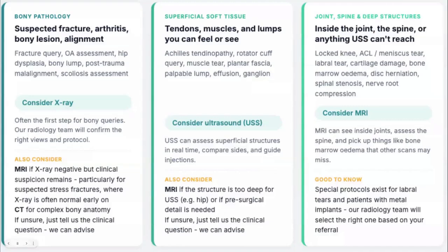There's quite a lot of detail here, but we can share these slides afterwards about different points to refer to, for example, when you might consider X-ray over ultrasound or MRI. So, for example, if the patient's had a query fracture, as I said, you do an X-ray. If you've got a patient with suspected arthritis, you would do an X-ray of the hands, for example, looking for any osteoarthritis or degenerative changes, loss of joint space you get with osteoarthritis, also within the knees and hips.